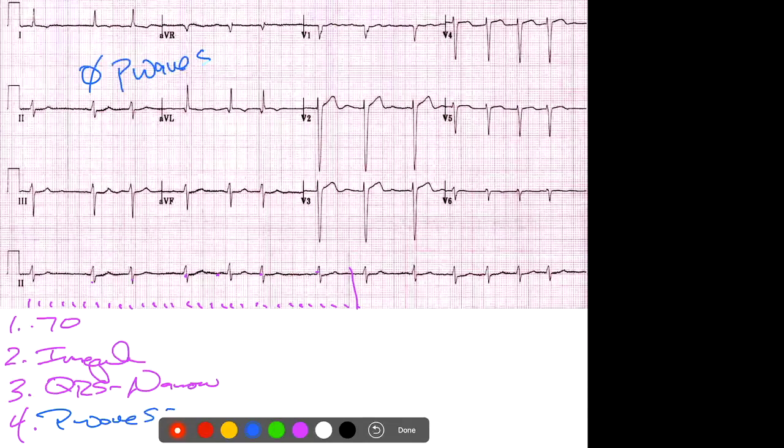Mr. Roberts, there's people here with me that are wondering about those little blips, specifically right under the not sign next to your P waves. If you look right straight here, yep. That's going to happen from time to time in this rhythm. And it's still not a P wave.